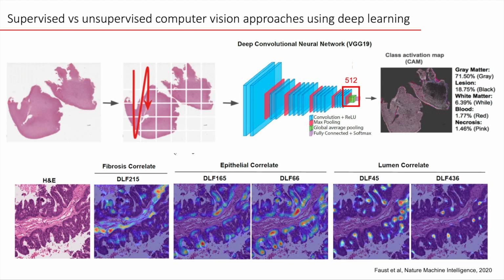Here's another two features that we found, diagnostic value for metastatic tumors. These are luminal correlates. As you can see, the activation occurs in this empty space within these gland-like papillary structures, and you can imagine that when it comes time to classify it, the computer, like the human, uses features to provide a specific class. Now, of course, humans are very good at translating these fundamental features into novel environments, and that's what makes us very good diagnostic clinicians.